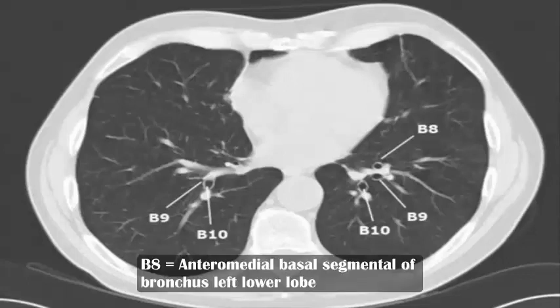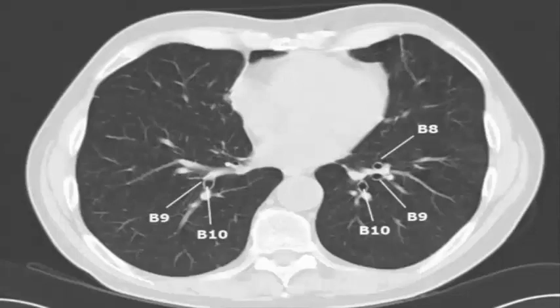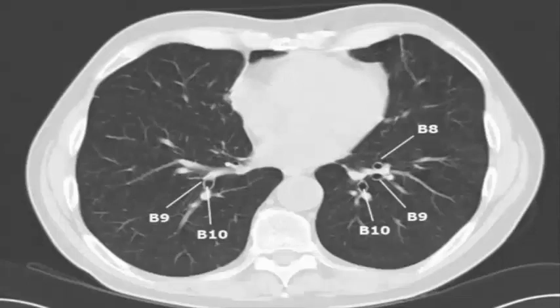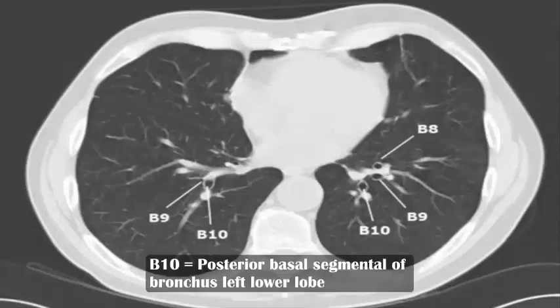B8 anterior basal segment of bronchus left lower lobe, B9 lateral basal segment of bronchus left lower lobe, B10 posterior basal segment of bronchus left lower lobe.